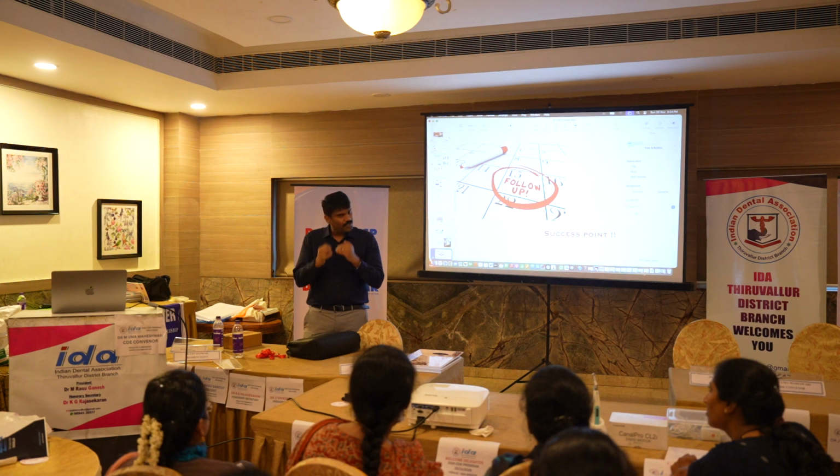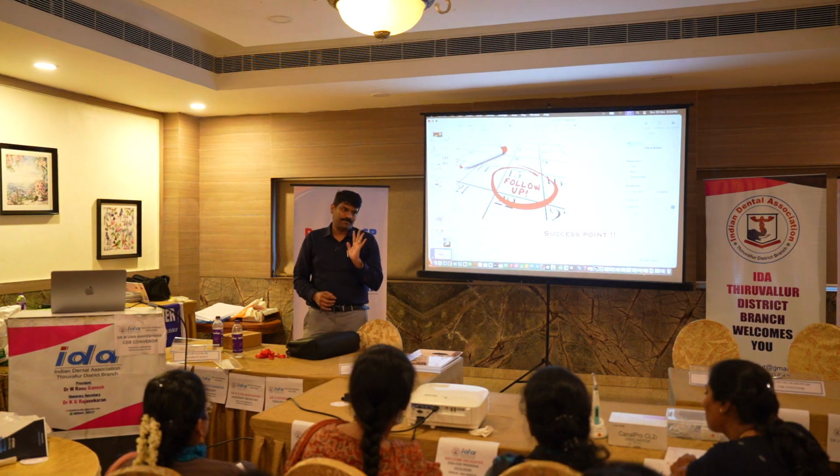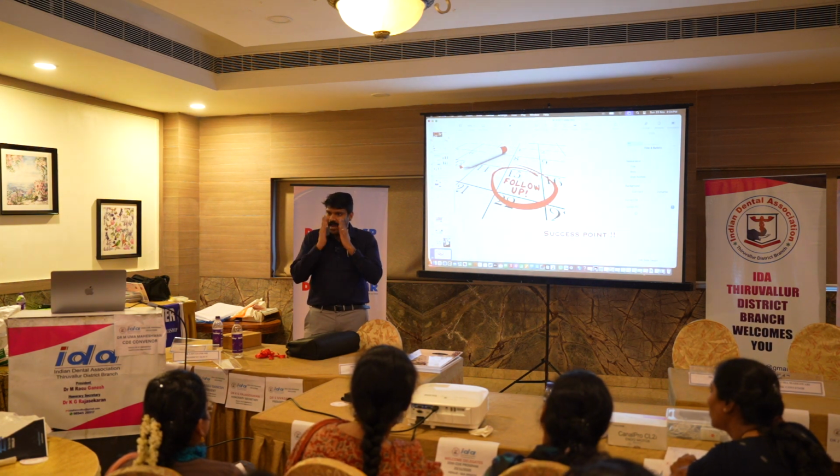Zirconia, we still do zirconia, but only for the anteriors. I have my kit: anterior zirconia, posterior stainless steel crown.